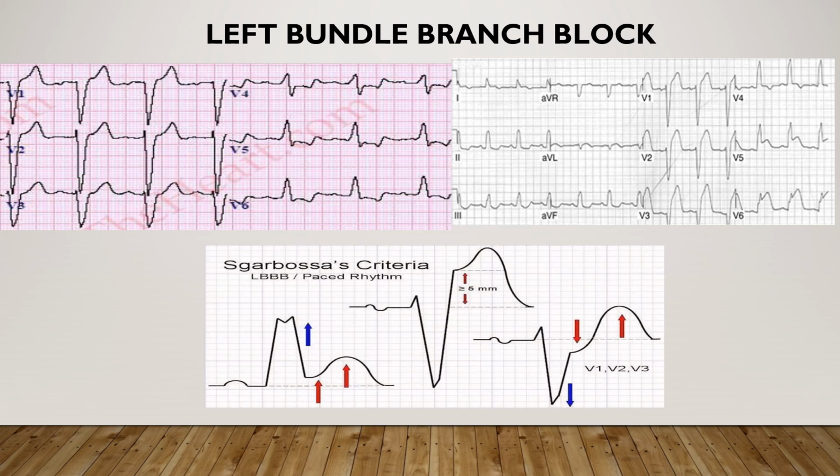And again, it is of note that it is much more difficult to diagnose acute ischemia in a patient with a pre-existing left bundle branch block pattern, but it's not impossible, as the Sgarbossa criteria can be helpful in this manner. Also, in patients who have paced rhythm, it can be helpful to diagnose ischemia. We already discussed concordance in the presence of ischemia, or profound discordant changes, such as, for example, ST segment elevation more than 5 millimeters, can also be a potential sign of cardiac ischemia.